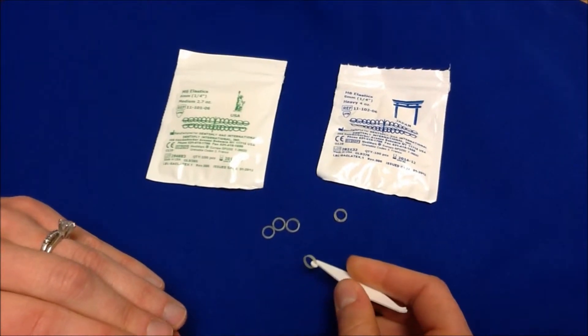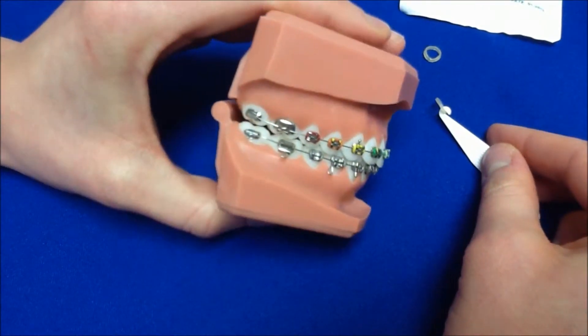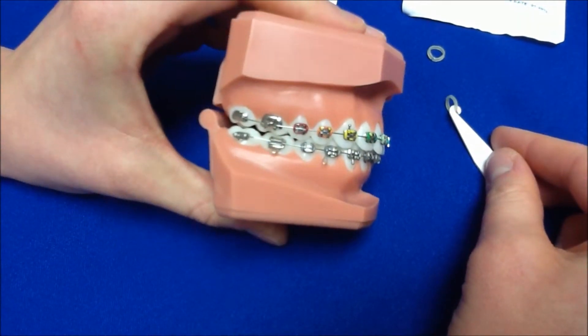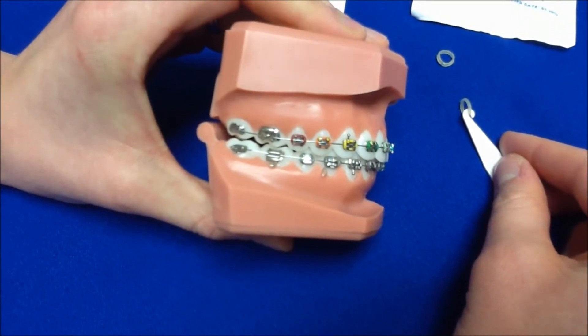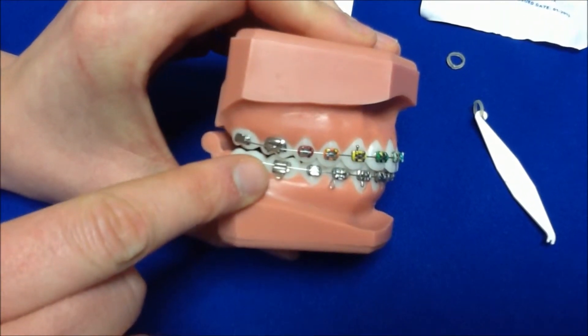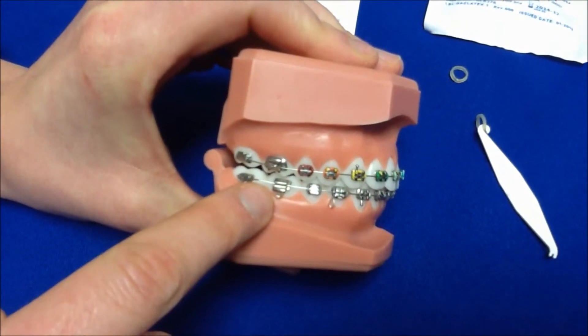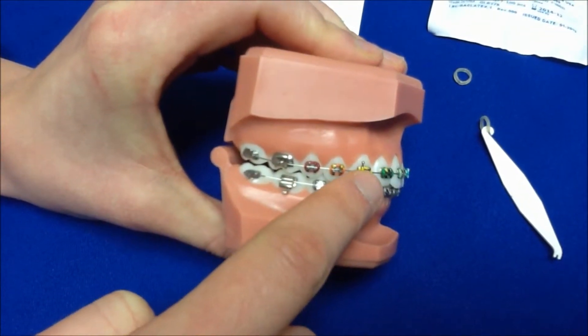Now let's go over some commonly worn elastics. One of the most common elastics worn in the office are class II elastics. Class II elastics attach from the lower molar to the upper canine.